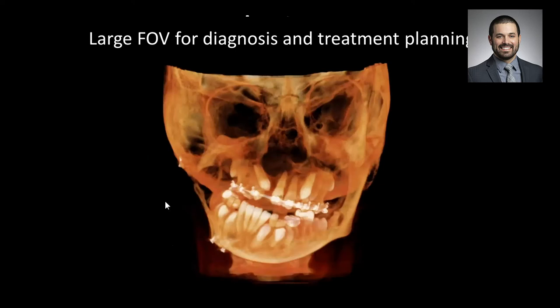So here's our large field of view for general diagnosis and treatment planning. This is a young patient with cleft lip and palate and hemimandibular hypoplasia with an associated occlusal cant. And the 3D information here is more or less necessary to address the cant and where everything is.